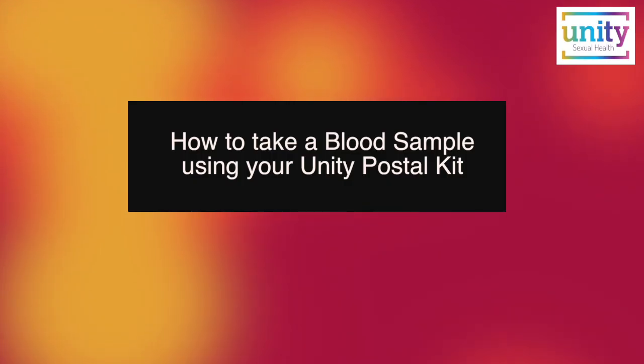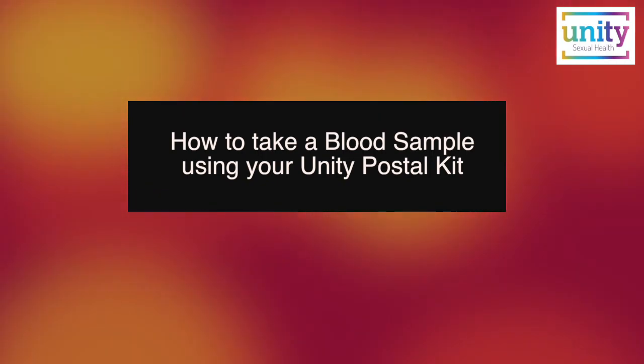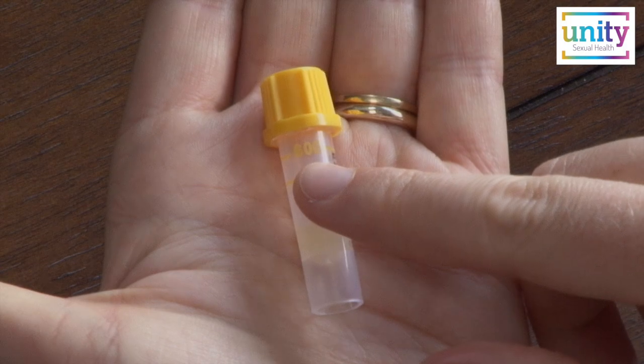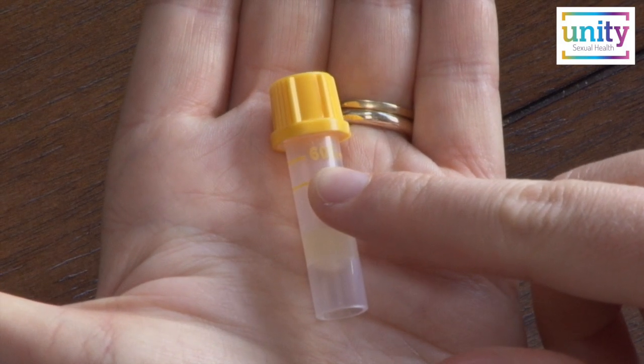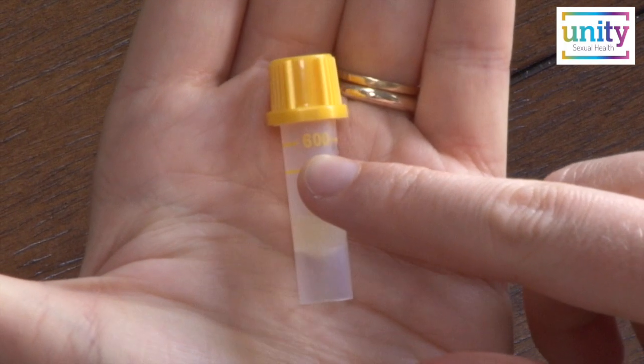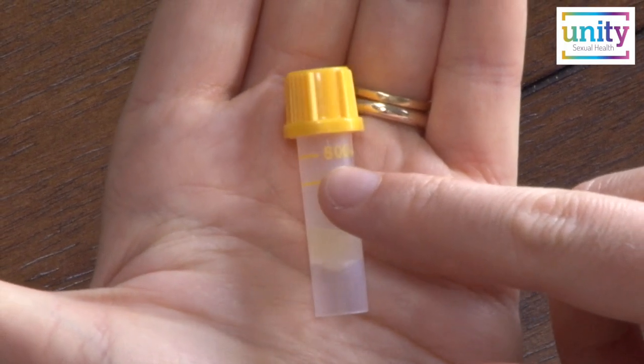You may be watching this film because you have ordered an STI postal kit through the Unity website, or you are thinking of doing so. This film focuses on how to send us a full blood sample. It is important that your sample reaches the 600 point on the specimen tube, otherwise there may not be enough for testing and the laboratory may reject the sample.